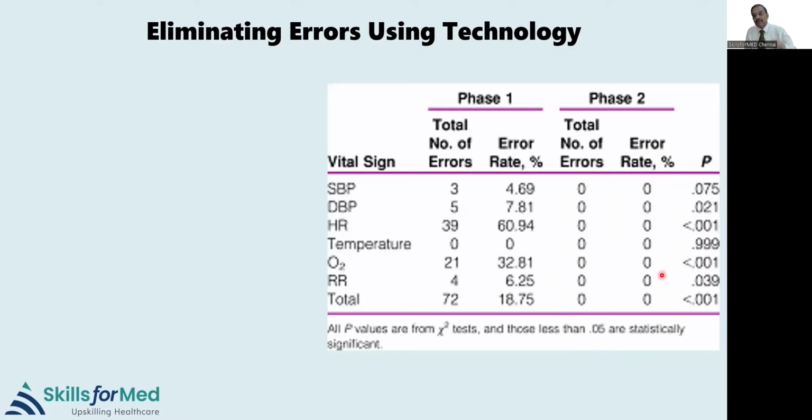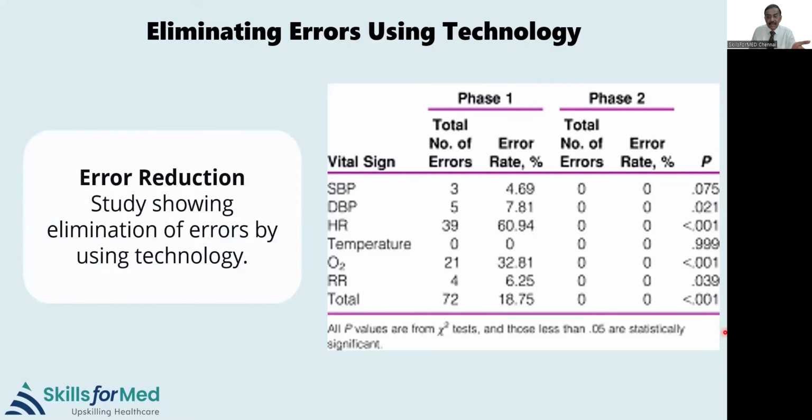Because with this technology, there's no transcription error, no bias, whatever, and you only have to make sure those probes are placed in the proper place. And now with the contactless remote monitoring system, you only need to keep it under the bed. So think about it. It's something which I wanted to point out, that today technology is possible where I don't even need to have given this talk. I'm sure in another maybe 3 to 5 years time, my talk will become obsolete because everybody is using technology. Okay, so that's something to consider.